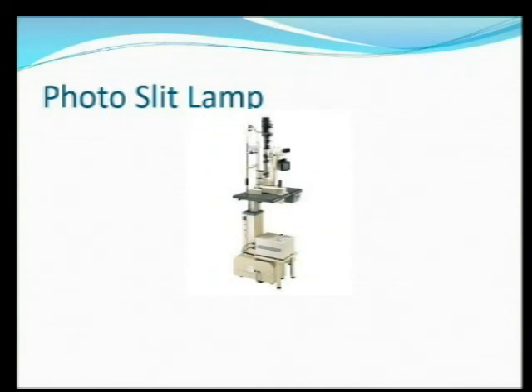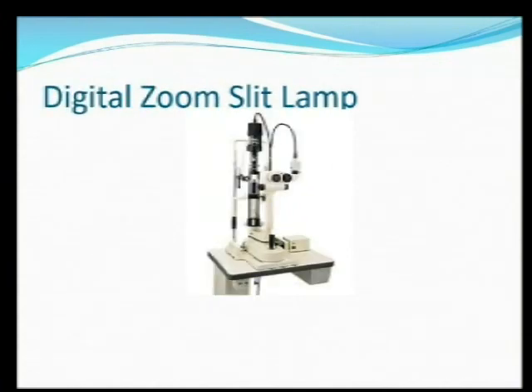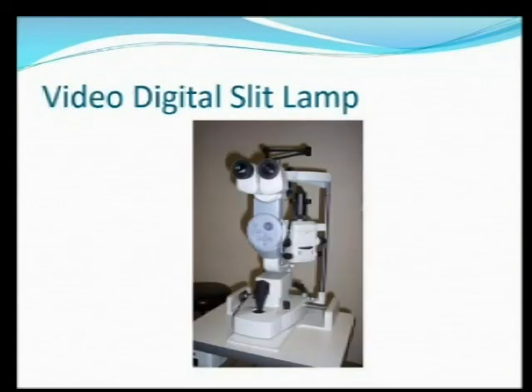Photo slit lamps make life a lot easier, and fortunately, we've got a brand new one at the college that you'll get a chance to work with this weekend. Just the capabilities of what you can see has improved dramatically over the years. The ability to capture digital images and to also capture video of actual eyes and contact lens fits make it great to explain to patients. In an educational setting, make it great to explain to the students.